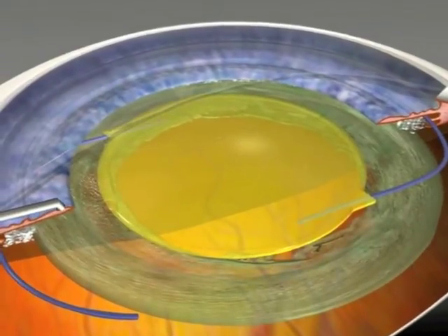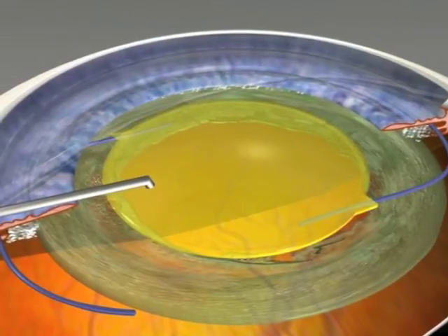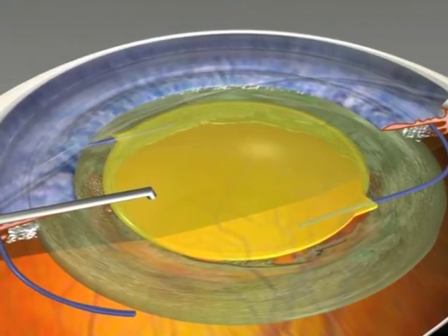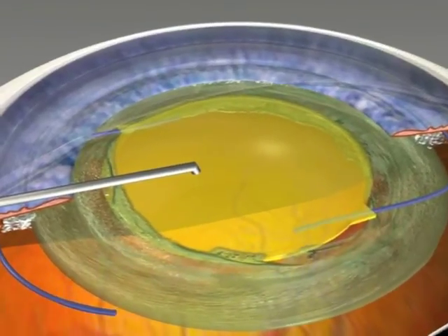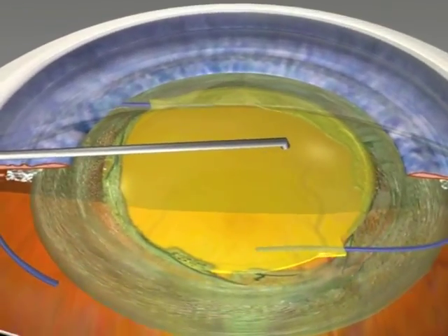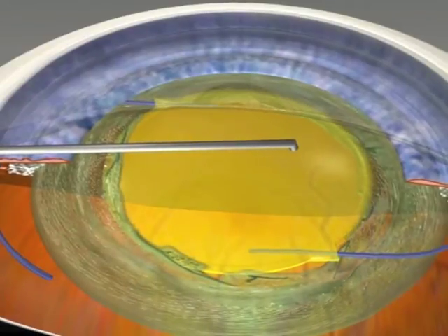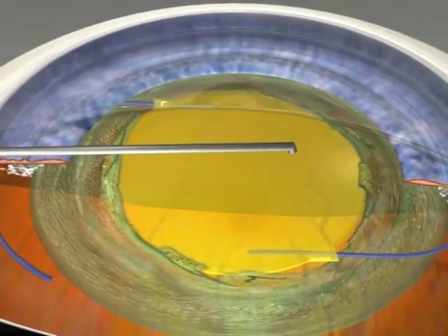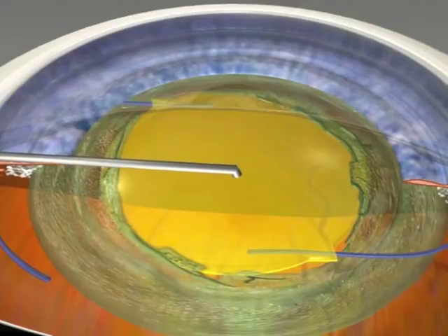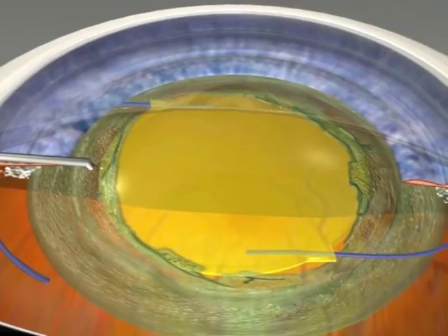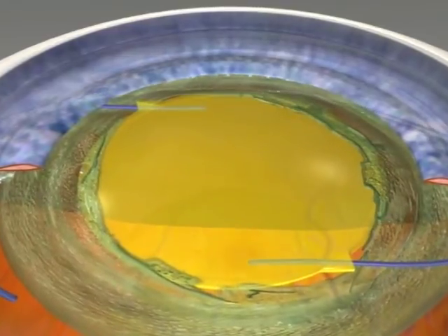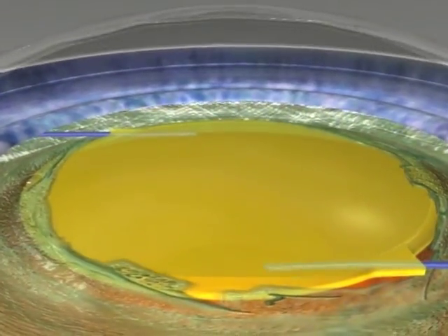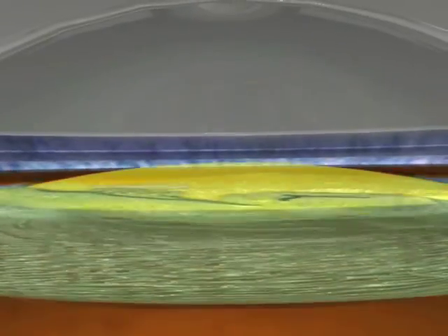This can be done with a vitrector. Sometimes loose sulcus lenses present with quite a large opening in the membrane. It does not take much, even just little leaflets on each side. You can see that's not a tight optic capture, but without vitreous pushing the lens forward or large Sombring's ring, this is often enough to stabilize a sulcus lens.